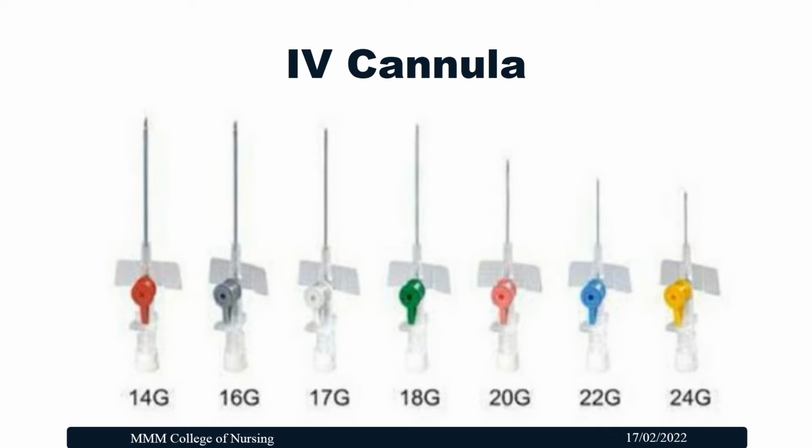But other than this, when we need to administer a larger amount of fluid in a shorter duration of time, then we have to select a bigger size of IV cannula, maybe 16 or 18 gauge, even 20. It can be used for blood transfusion also.